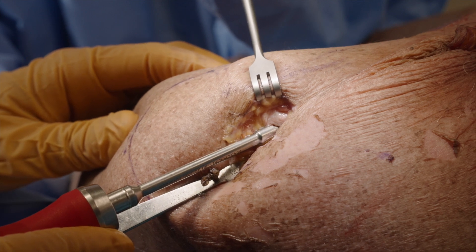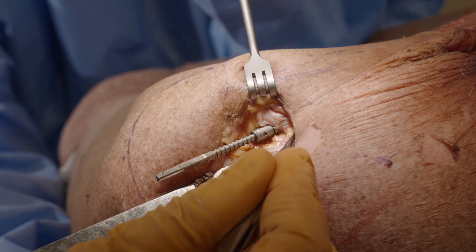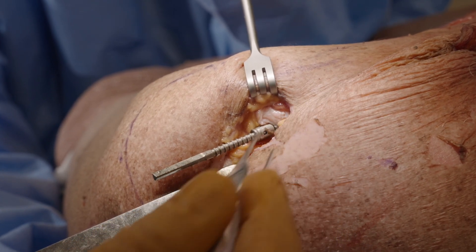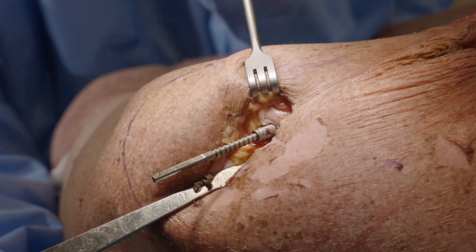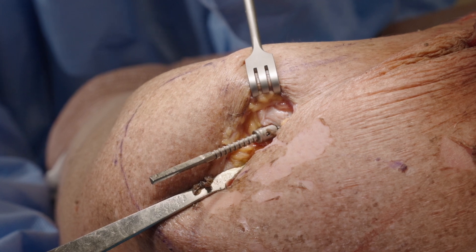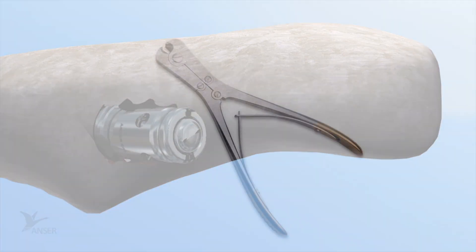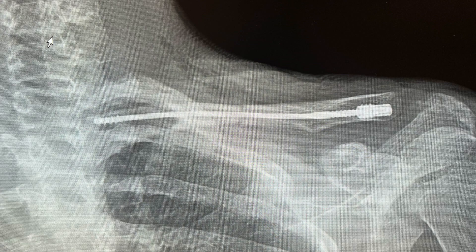Tip: when the Anser lateral fixation device is placed relatively deep into the lateral cortex, the Anser end cap may be blocked by the cortex. In this case, gently manipulate the Anser end cap inserter until it clears the cortex and the end cap can be advanced. When the Anser lateral fixation device is not placed deep enough, it may result in suboptimal fixation and hardware prominence. Cut the Anser clavicle pin to length flush to the Anser end cap using a universal end or side cutting pin cutter. Obtain final fluoroscopy images of the position of the Anser clavicle pin and fracture elements in two directions.